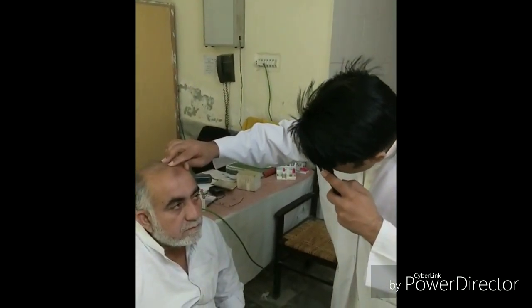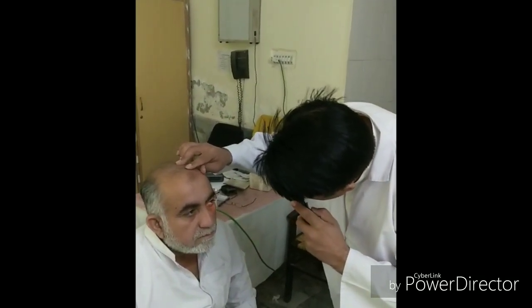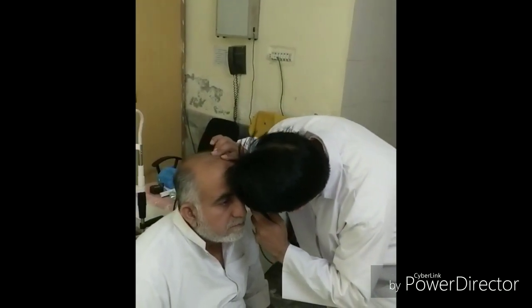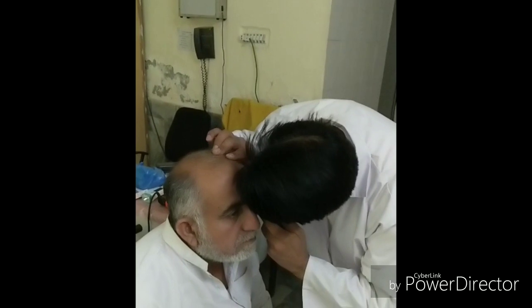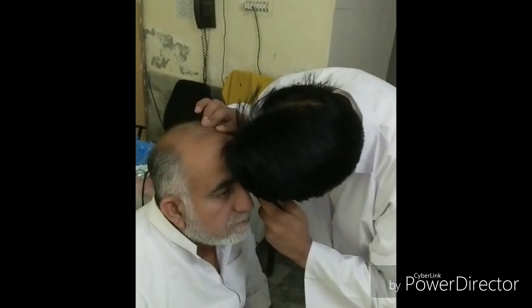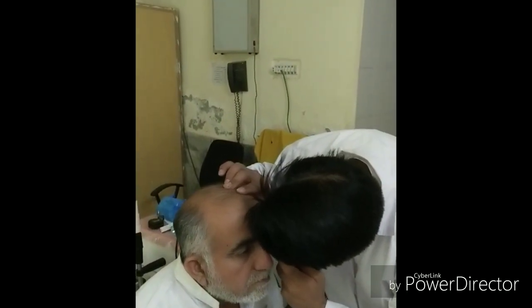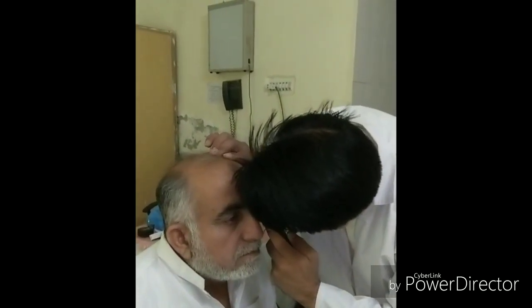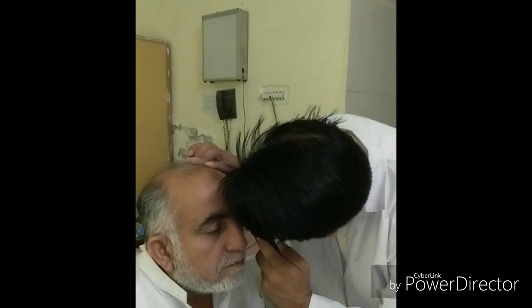Now applying that rule, we are examining the left eye of the patient with the left hand. Finally, ask the patient to look straight ahead into the light to examine the macula. This should be done last to avoid discomfort from the bright light. You can see the macula, the macular reflex, and assess for macular edema or macular hole. That was direct ophthalmoscopy — thank you very much.